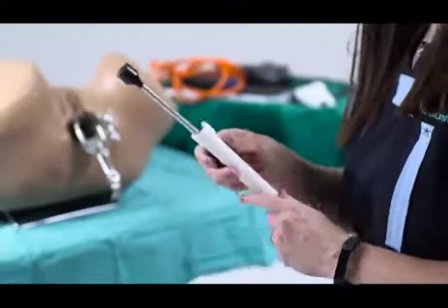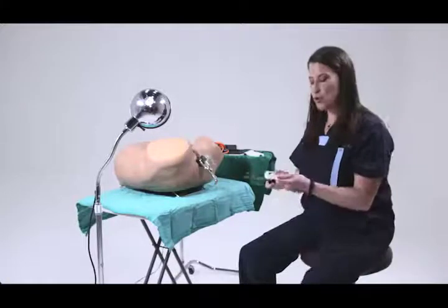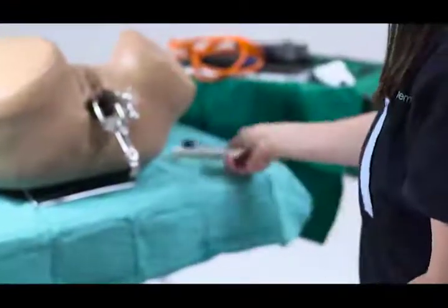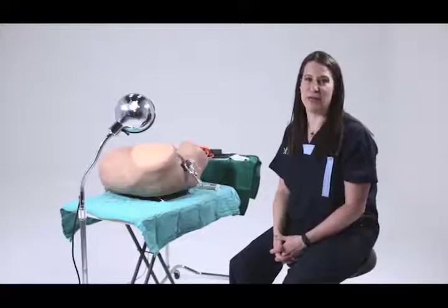This can be a glutaraldehyde solution or a bleach solution. They should not be autoclaved — they should be soaked with soapy water and then placed into high-level disinfection. And that's it. I hope that you will all enjoy this incredibly innovative new treatment for cervical pre-cancer.